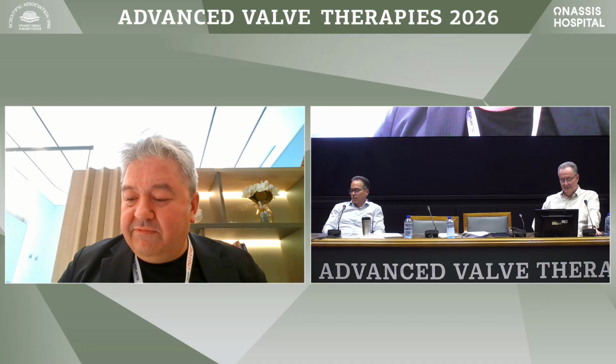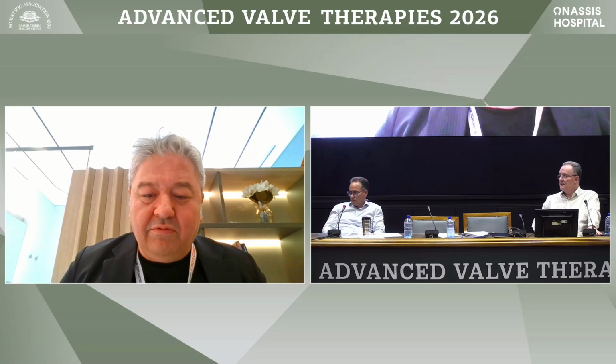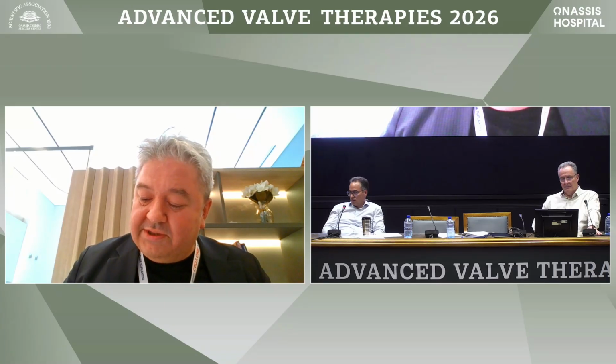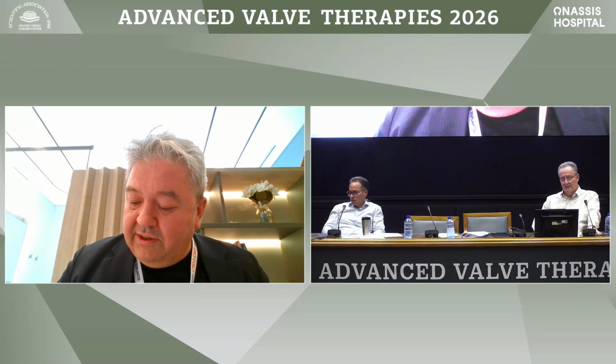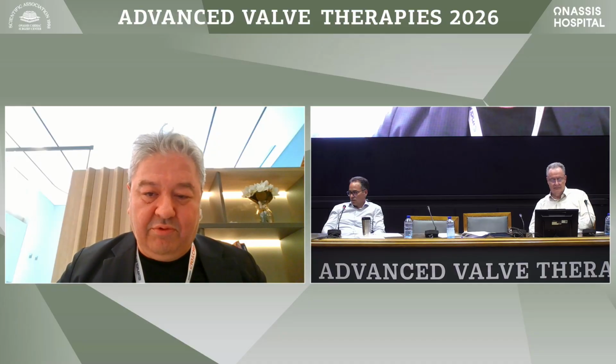Good question. This is a very important question, and it's a very hard topic. We always discuss this. But the main hemolytic findings are observed in the early period. Then we carefully observe these patients, and the hemolytic status will resolve. But if you don't close the leak appropriately, and some small residual leaks remain, it's another indication for another procedure.